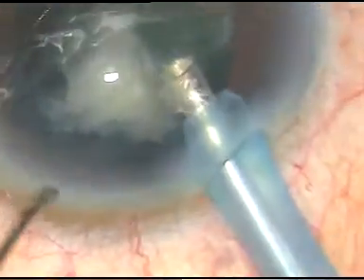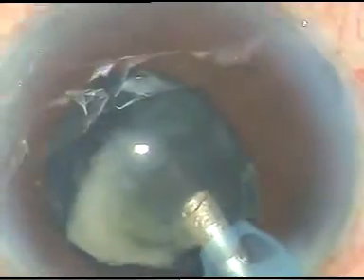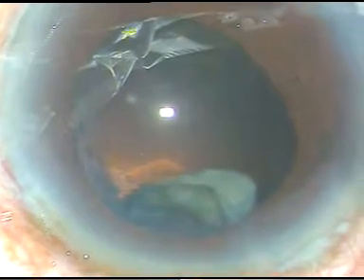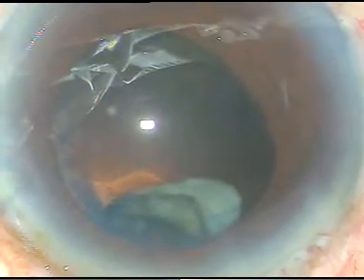Now I go into the anterior chamber. Flow rate is 30, vacuum is 250, and ultrasonic energy is 30%, and I am almost through. But here it is. A piece tends to go into the vitreous cavity. A part of the epinuclear sheet tends to go into the vitreous cavity.